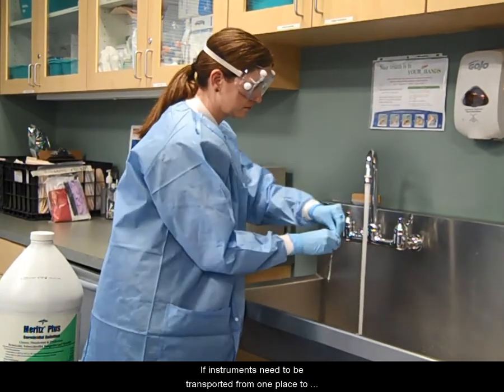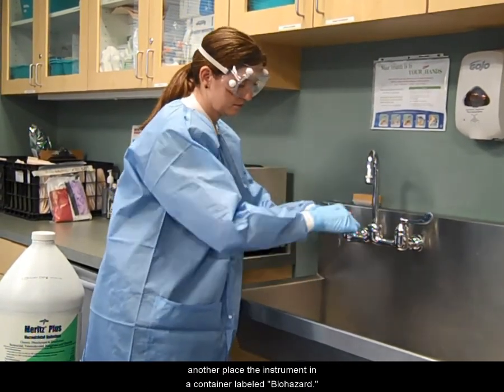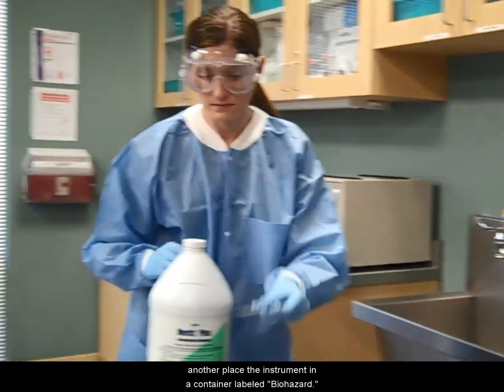If instruments need to be transported from one place to another, place the instrument in a container labeled Biohazard.